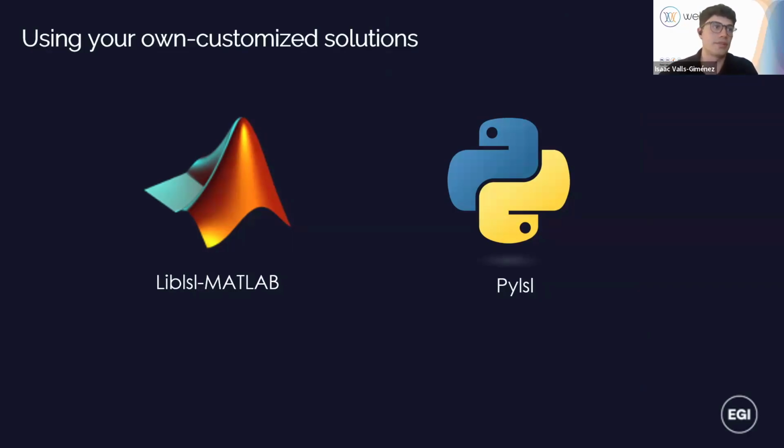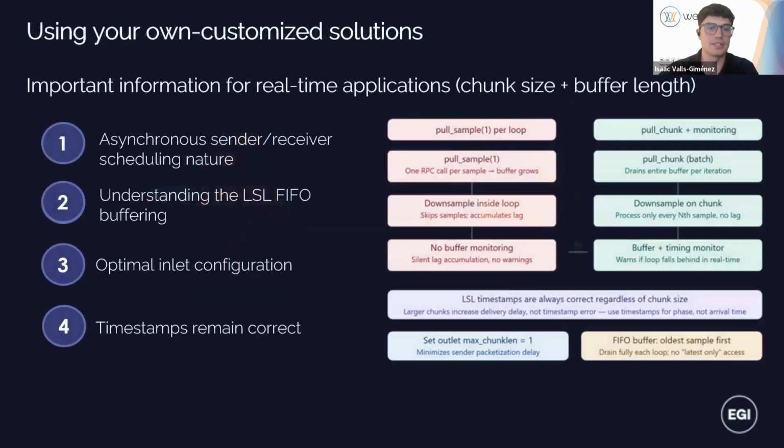Then you can maybe use the Python and MATLAB libraries for LSL. And in these next slides, I will walk you through a bit of basics on what is important to configure these applications. Before we dive into that, I want to spend a few minutes understanding how LSL sends and receives data, because this will directly impact the parameters that you need to set in your scripts.